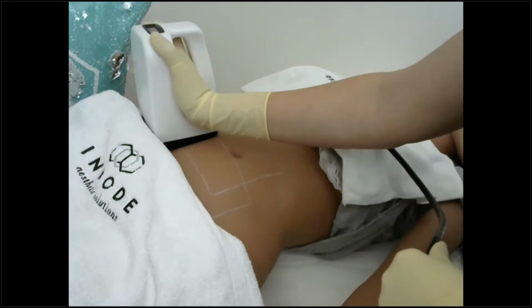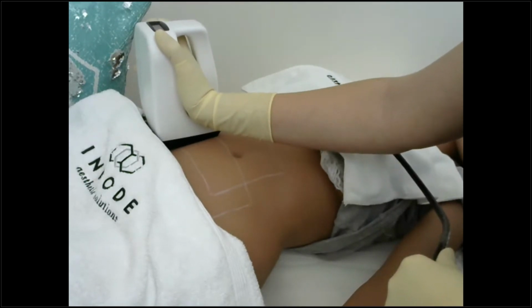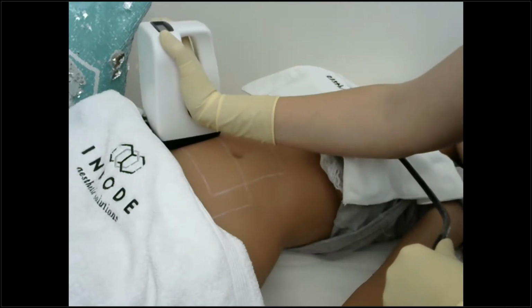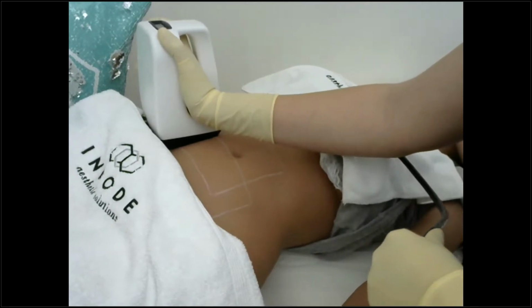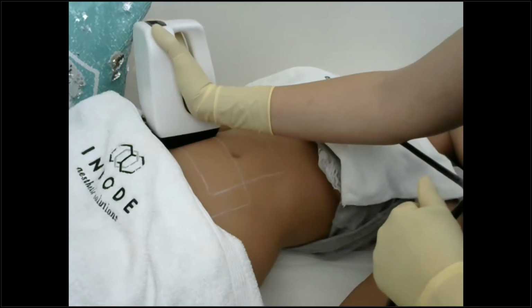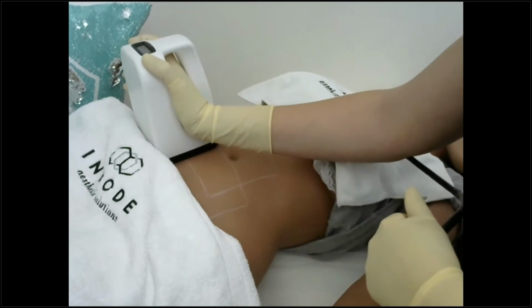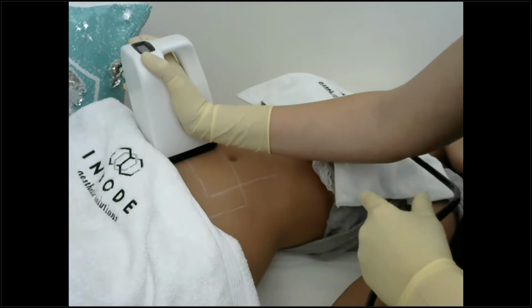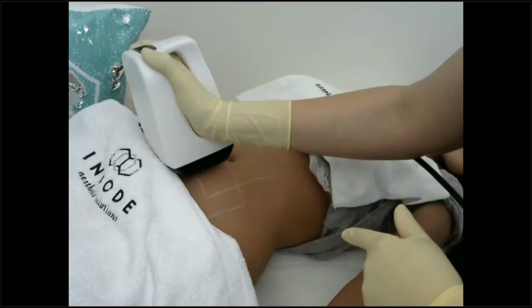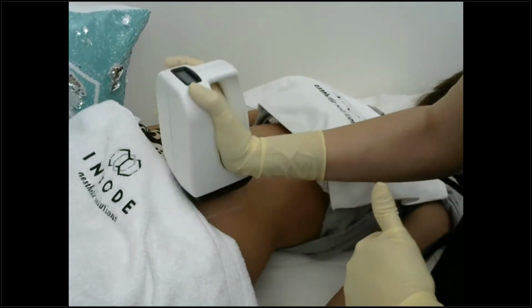Okay, so I will go 1, 2, 3. The pulse will end. It will give a high voltage pulse, and I release the pedal and press it again. Okay, so 1, 2, 3, 4, and that high voltage pulse, and then move on. And we talked about a minimal overlapping of 10 to 20%, and again 2 pulses of 4 seconds, and again, and again.